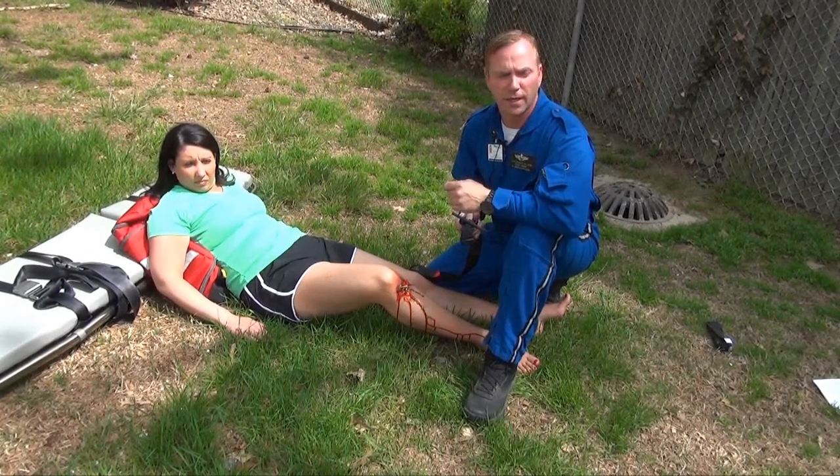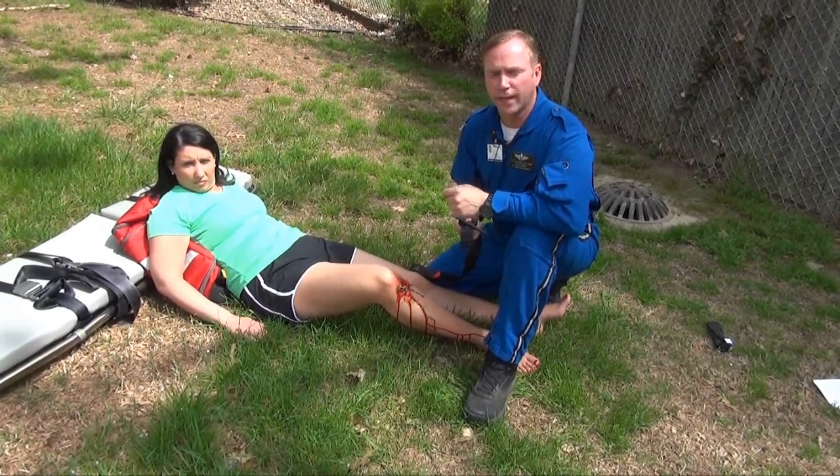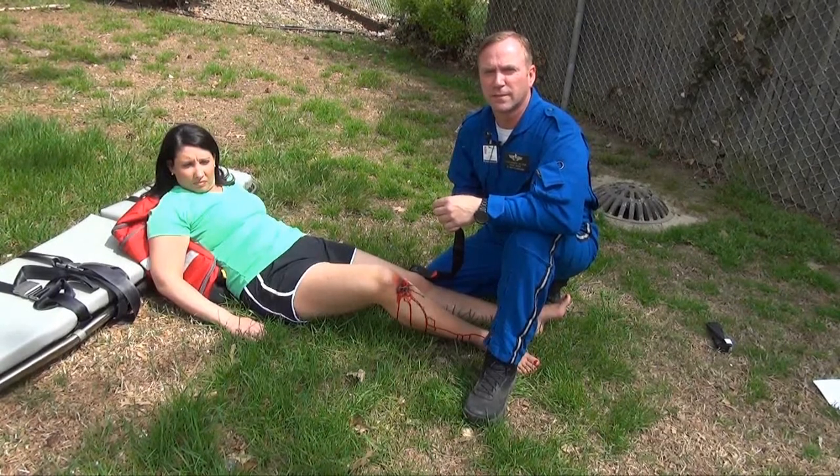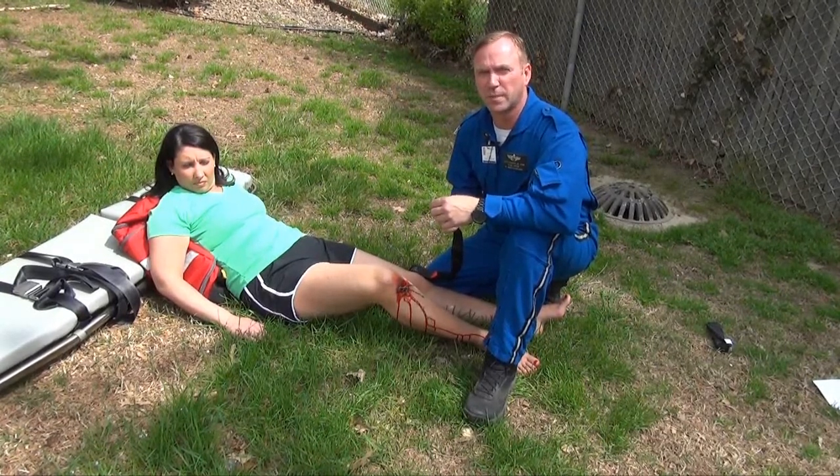Tourniquet use has often been called a last resort. I don't like that. Tourniquets should be utilized when any other means to control a hemorrhage has been exhausted.